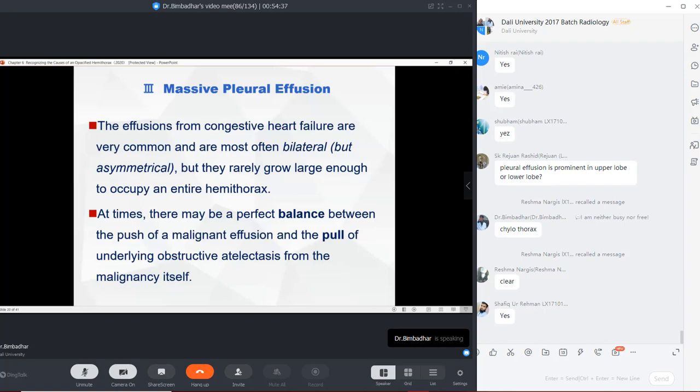So mixed features can also be seen, but still you have to remember it in a plain way that the contralateral mediastinal shift and contralateral tracheal deviation happen because of the problem present down in the pleural cavity, acting as a counteractive mass pushing them. But ipsilateral tracheal pulling and ipsilateral mediastinal shift happen in atelectasis. It actually comes down through a little practice, but that is the basic scenario behind it.